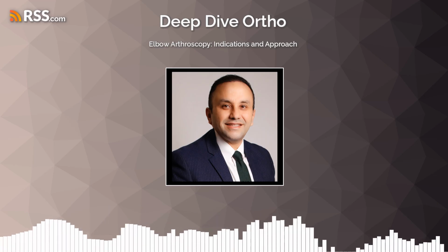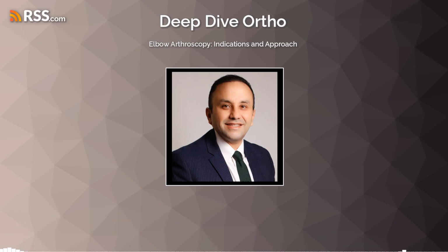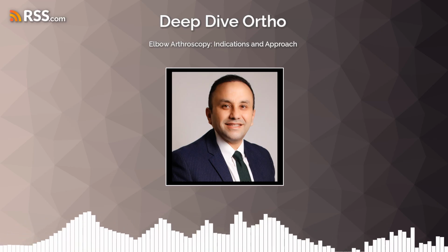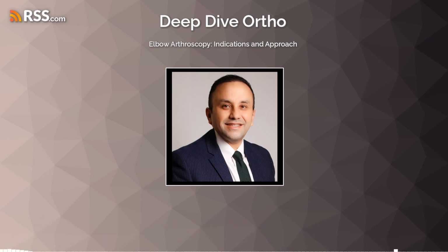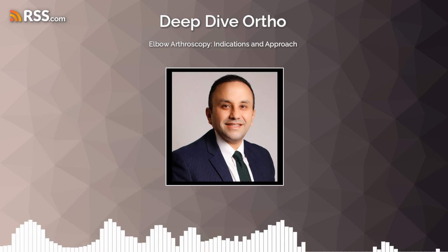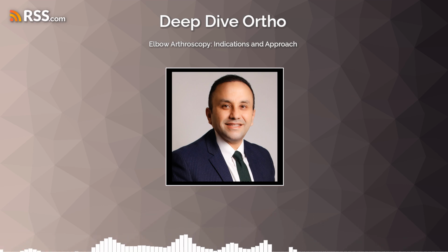The key insight from these applications is that endoscopic techniques are increasingly extending their reach beyond the joint, offering less invasive yet highly precise solutions for common soft tissue pathologies and nerve entrapments around the elbow, leading to faster recovery and better cosmetic outcomes. That's a truly expansive view of endoscopy's reach beyond the joint.